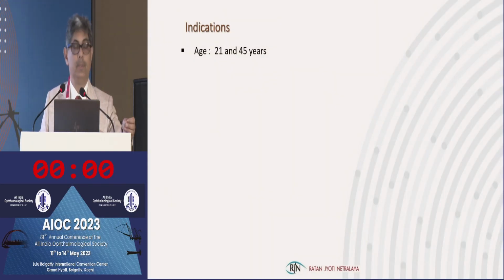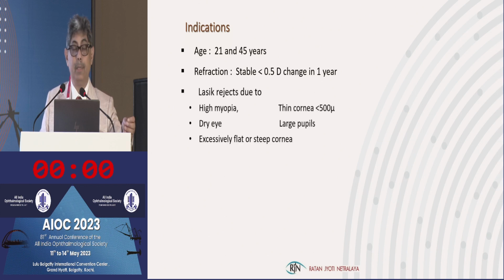And it is indicated in patients of 21 to 45 years of age. Refraction stability should be there in all these eyes, with less than 0.5 diopter change in 1 year. It is for the LASIK.